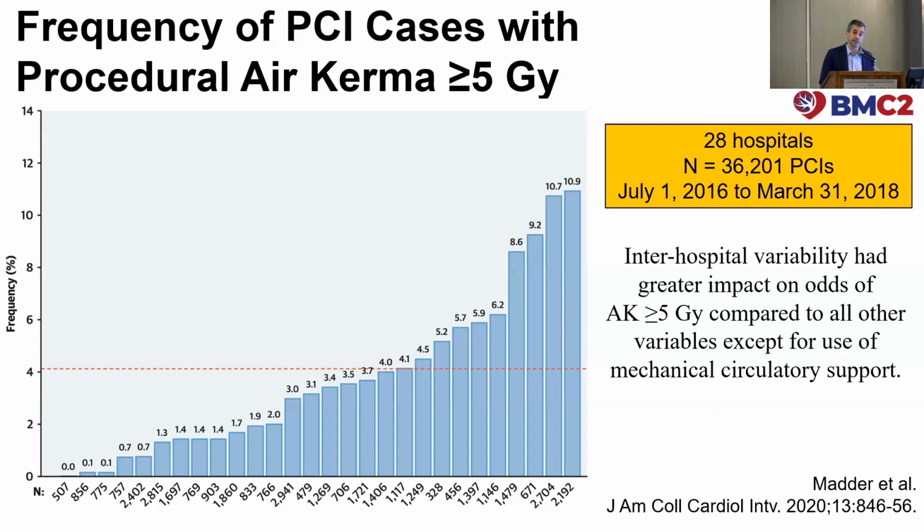And I think the other thing to think about is not only is getting these doses down important for patients, to lower their doses, but remember all of the radiation that you are getting standing there in the cath lab is coming from scatter radiation off of that patient. If you can lower the patient's dose, you will lower your dose.